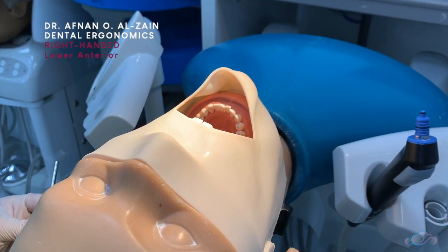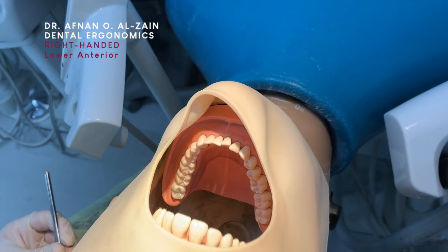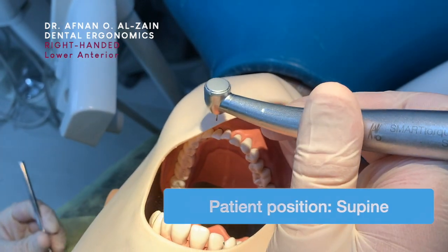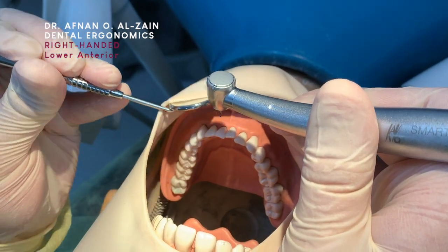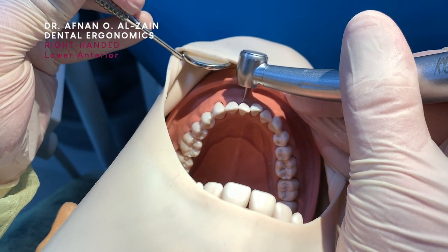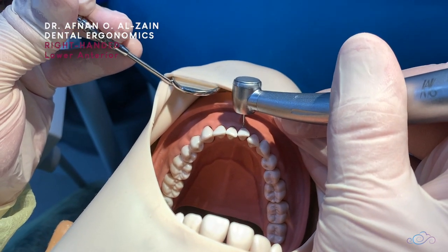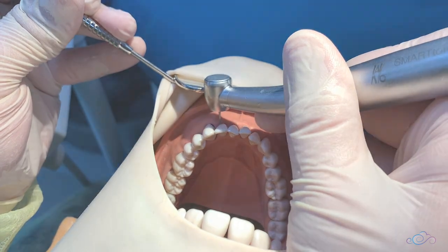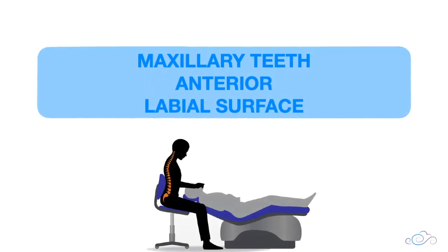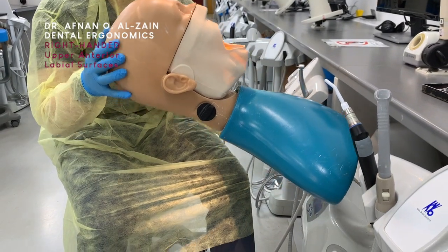Moving on to the labial surfaces of the anterior mandibular teeth. For working on the lower labial surfaces, you're going to place the patient in a supine position and sit behind the patient or the dummy head. You're going to retract the lip with the mirror, place the handpiece perpendicular to the surface, and place proper finger support.